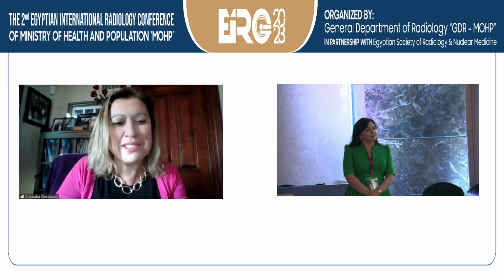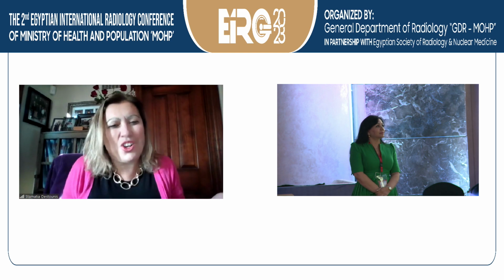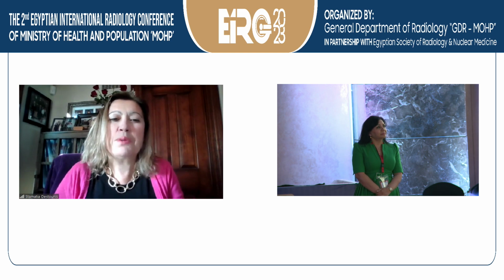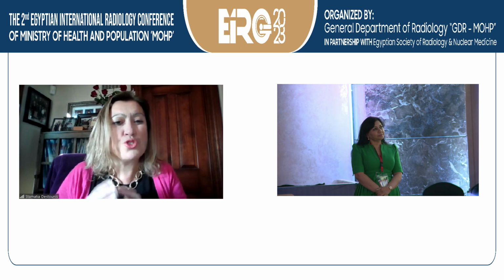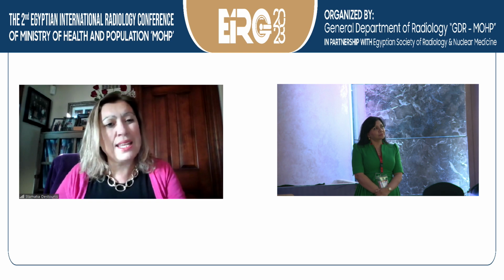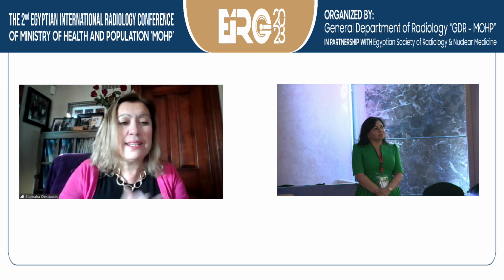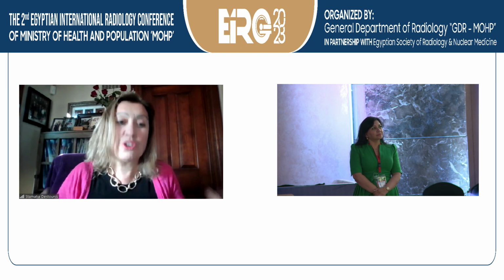Whether it may turn out to be a BIRADS 2 or a 4, it's a catch-all, so we want people to really look at that area that enhances. And if it's new, if you have priors, call it a mass, call it non-mass enhancement. Go ahead and work it up and just not ignore it.